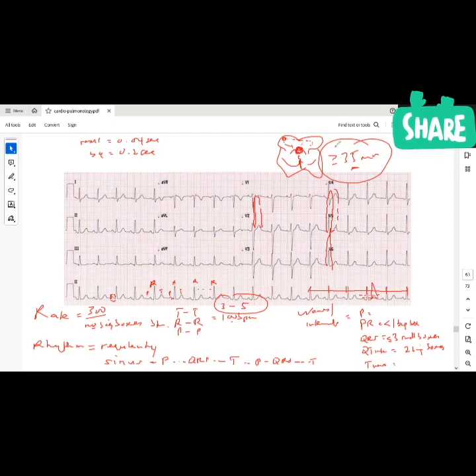All right. Now let's get down to business. Arrhythmias.